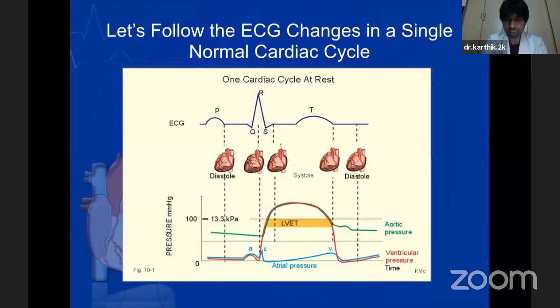Now, the impulses travel from the atria to the AV junctional node, and after a brief relay, the impulses traverse across the bundle of His into the right and left bundle branches and activate the ventricles. So we can see that after the onset of the QRS complex, the ventricular systole is starting and the ventricles are contracting to eject the blood. Now, the whole process takes approximately 80 milliseconds, plus or minus.